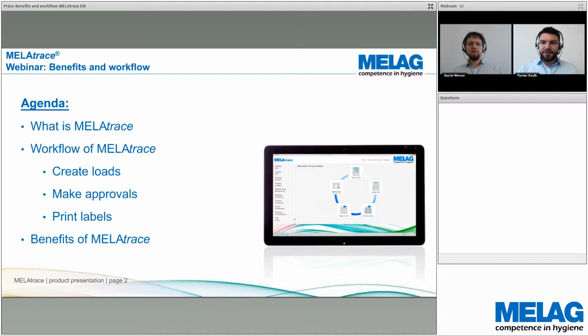Today's topic will be as follows. At first, I will tell you something about MELAtrace, so what is it? The next step will be a live demonstration of the workflow of MELAtrace. So you will learn how creating loads, making approvals, and printing labels at the end. And of course, at the end of the webinar, I will tell you something about the benefits of MELAtrace.